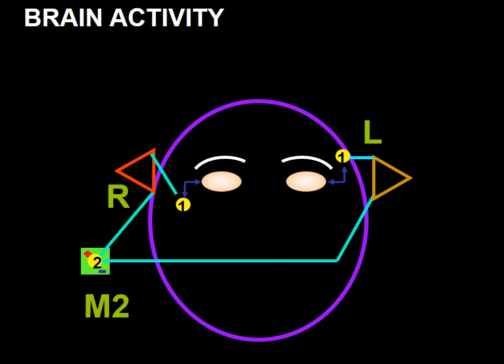Using this montage, all activity arising from the brain will be in phase, as depicted by the different colored waves representing the different amplifiers.